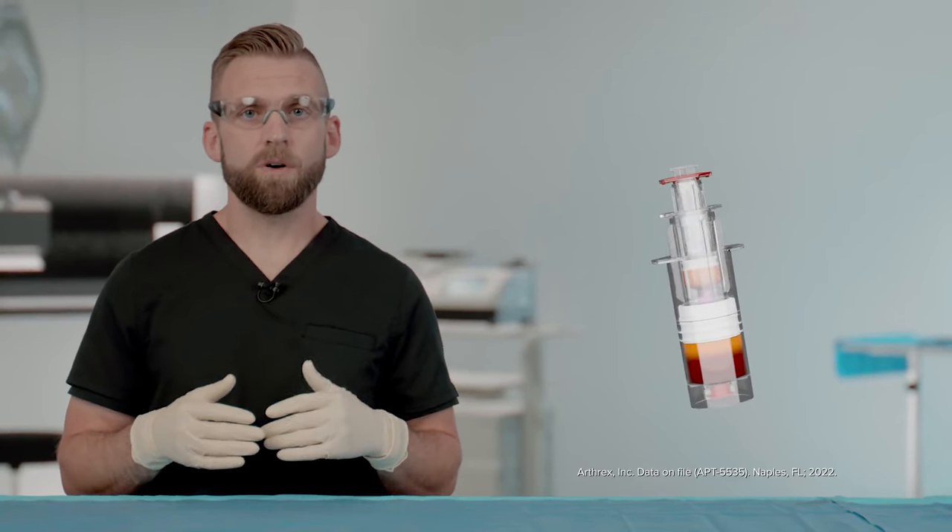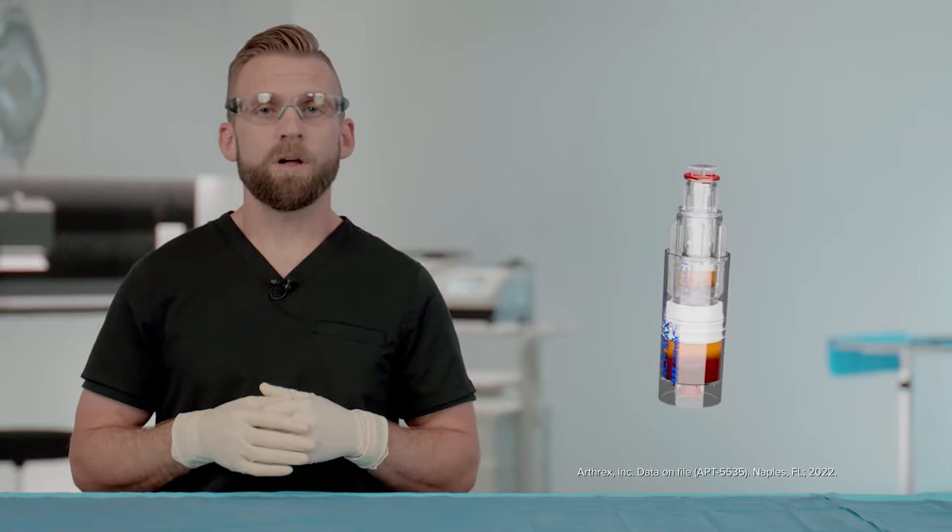ACP Max is an expansion of the tried-and-true ACP system, allowing us to process a larger volume, concentrating a higher number of platelets, while still producing a neutrophil-reduced PRP.